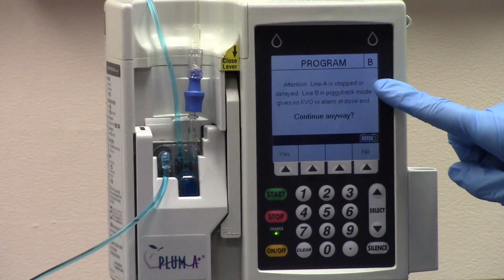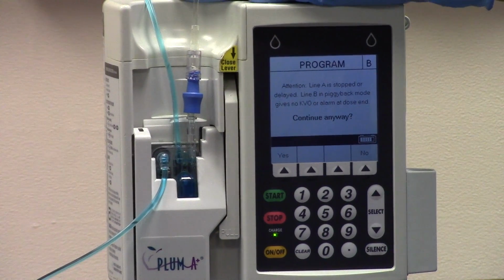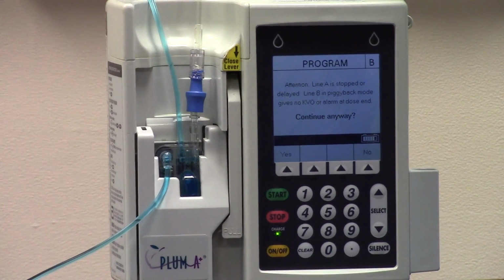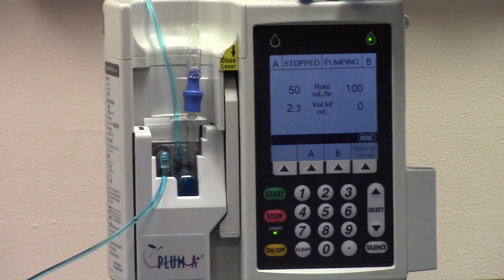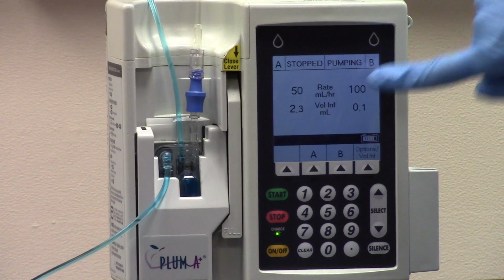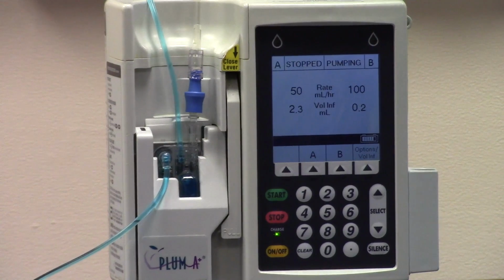It's asking me that line A is stopped. Do I want to continue? With this pump, you have two options. You can infuse the primary and the piggyback at the same time, or just do one. For our purposes, I'm going to just do one. So I'll hit yes, continue. And you see that my piggyback is running. The light is flashing. It says pumping. My primary, there's no light flashing, and it says stopped. So my piggyback is now infusing.